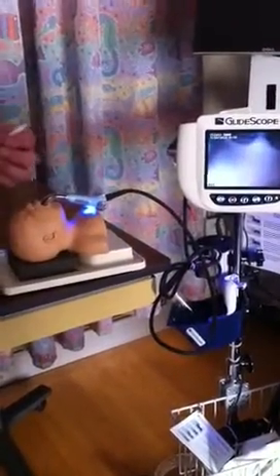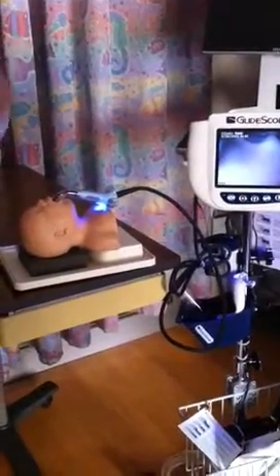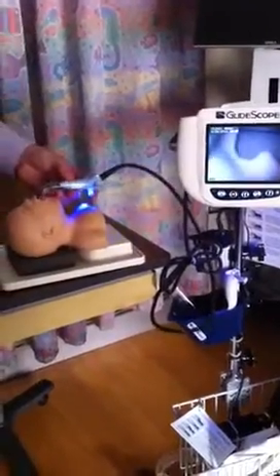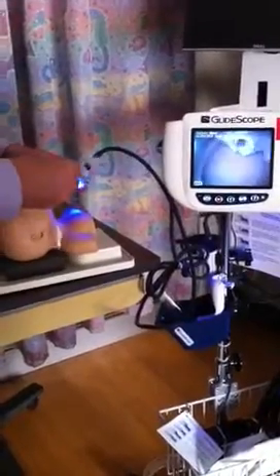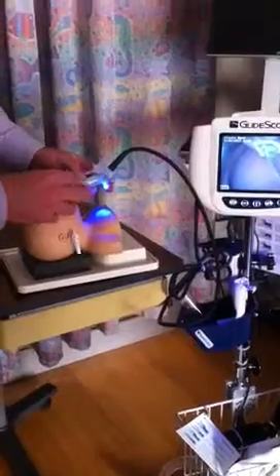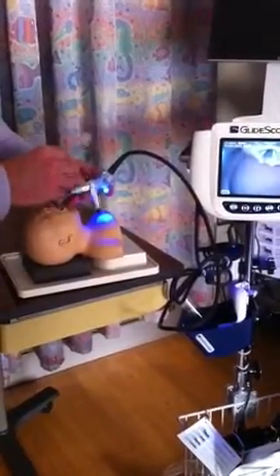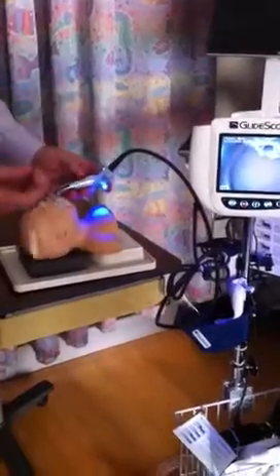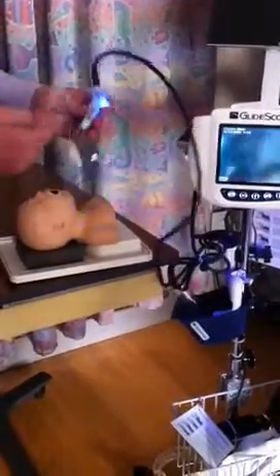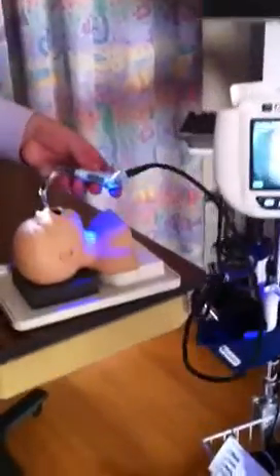One other tip is to use a stylet and bend it to this view, or to a curve just like this, kind of a hockey stick. I don't have a stylet in here, so you can see it's a little hard to get. But you can see that it'll be a little harder without it — you have to be too flexible to get in there because with this curve, you're using it to see around the corner. You don't have that direct line of sight anymore.